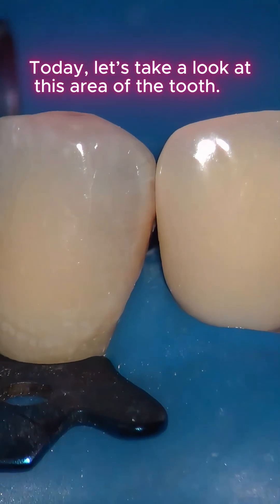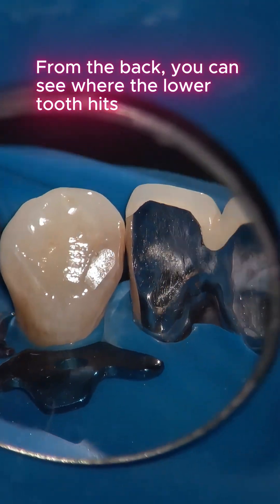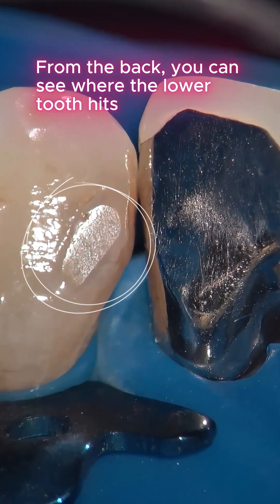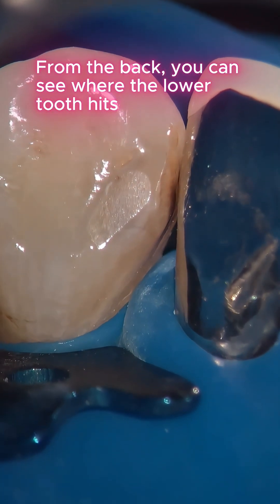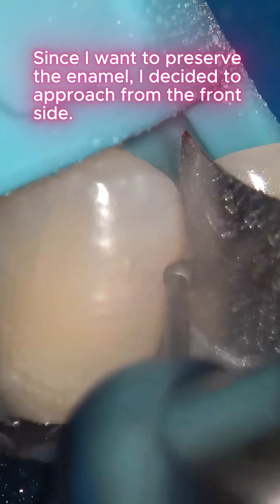Today, let's take a look at this area of the tooth. There's decay here — from the back you can see where the lower tooth hits. Since I want to preserve the enamel, I decided to approach from the front side.